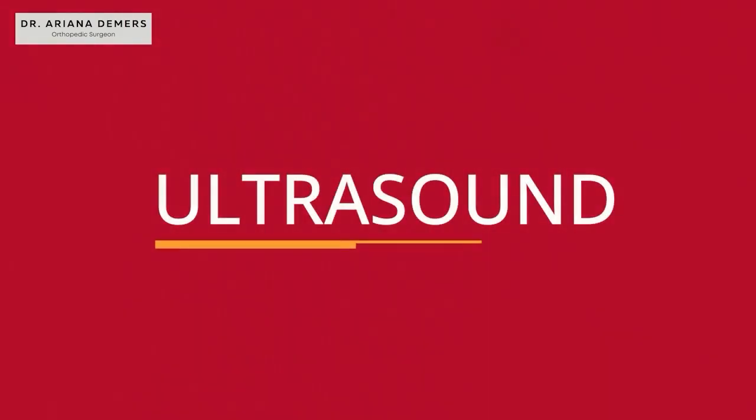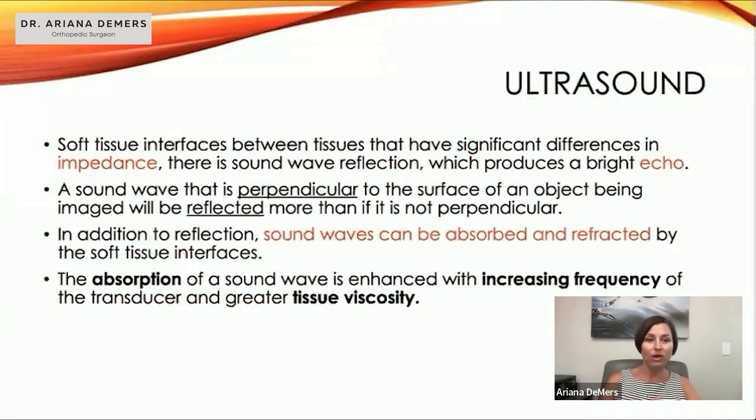So ultrasound shows the soft tissue interfaces between the different densities or impedance, and there's a sound wave reflection that produces an echo. And that sound wave is perpendicular to the surface of an object being imaged, and that will be reflected more than if it's not perpendicular, it may bounce off.